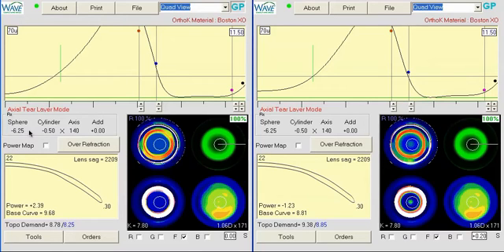With ortho-K, the more myopia you correct, the smaller the treatment zone becomes, and the different strategies we can employ to get a slightly larger treatment zone will probably help, but I'm not sure if it'll remove the symptoms altogether. That said, I think your second design looks pretty good. I see that we've got about plus 0.2 shape factor added in, and that does push the curve back closer to the pupil as measured through the topographer.